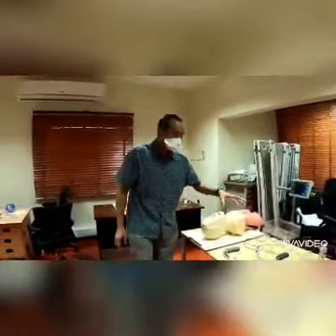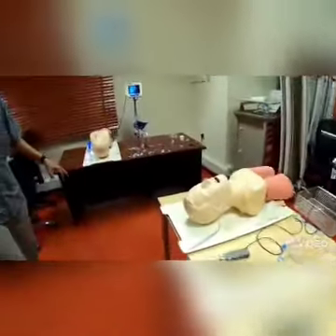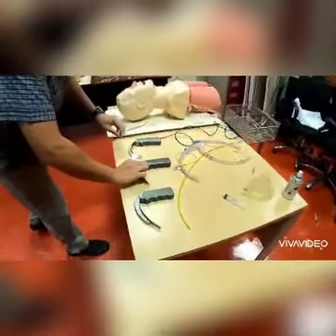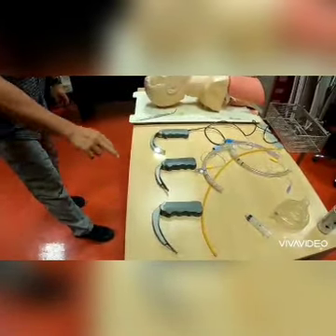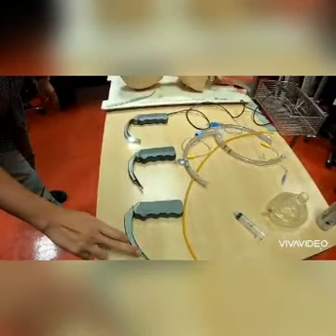The two most common devices are either the CMAC device or the Glidescope. So today we're going to demonstrate very quickly the use of both devices. As you can see, CMAC has several types of blade: a D blade, a size 3 and a size 4.